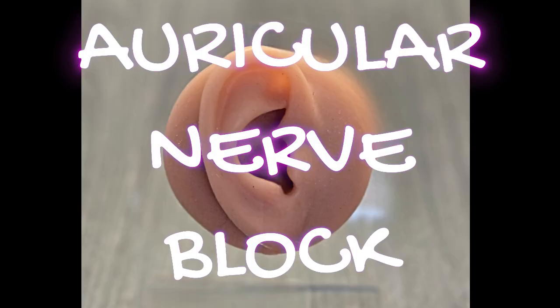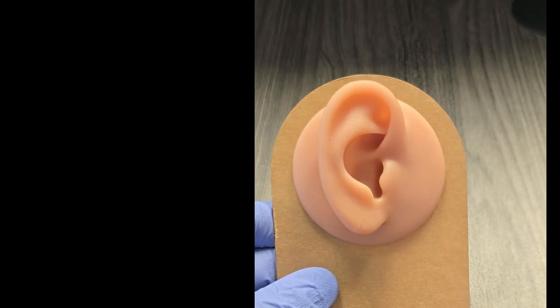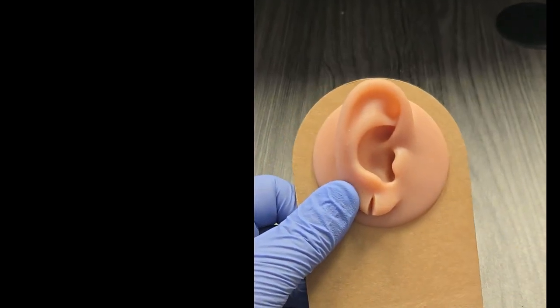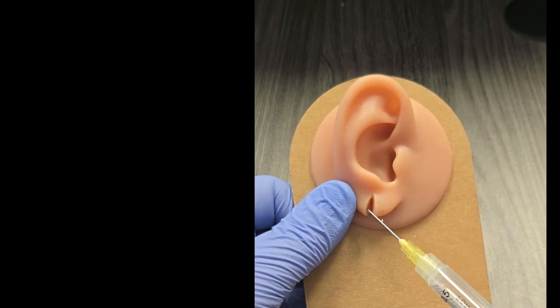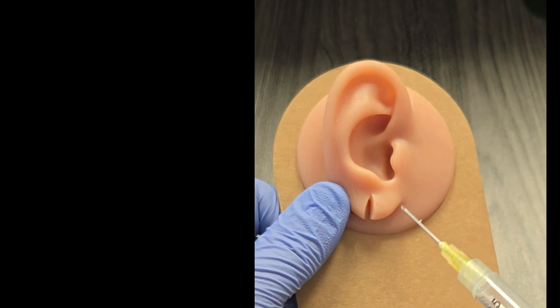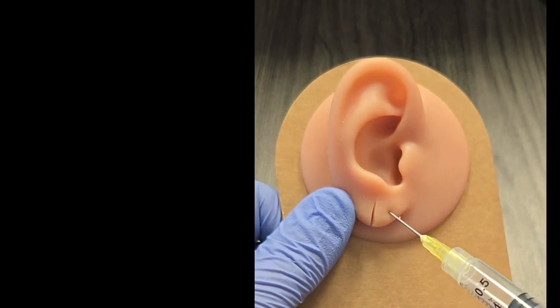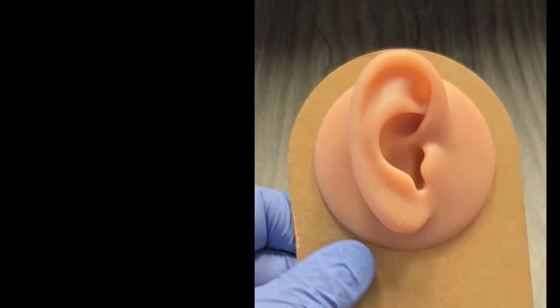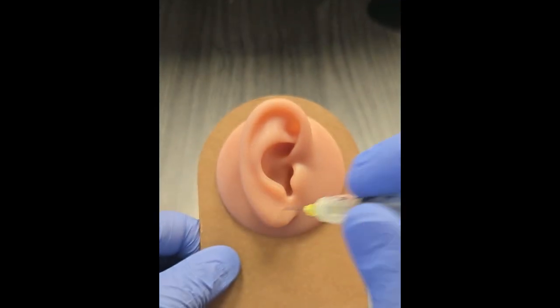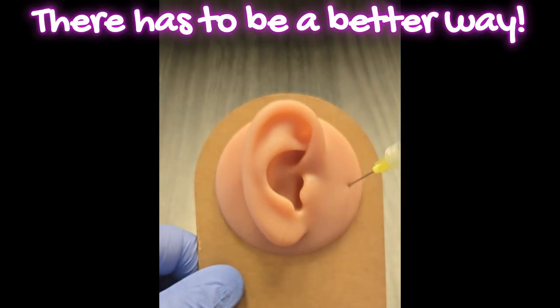Hey everybody, it's Dr. Rahimi here. Today we're going to be talking about auricular nerve blocks. Here we have an ear, and I can either inject directly — stab it several times with the needle, which is going to hurt quite a bit — or I can use a nerve block to get the whole ear numbed up.